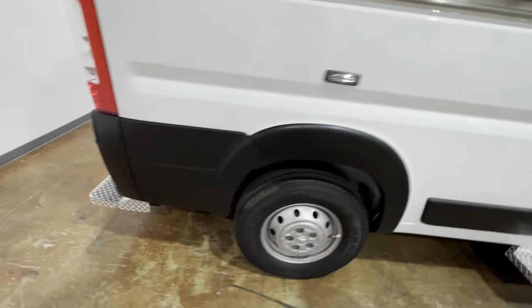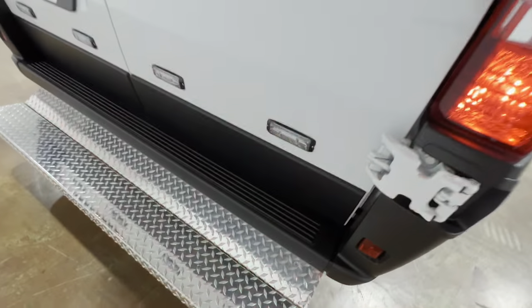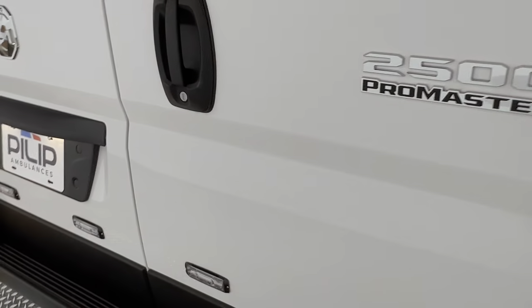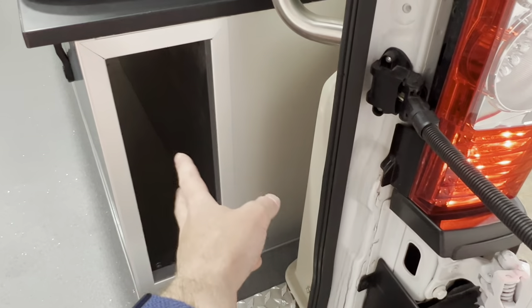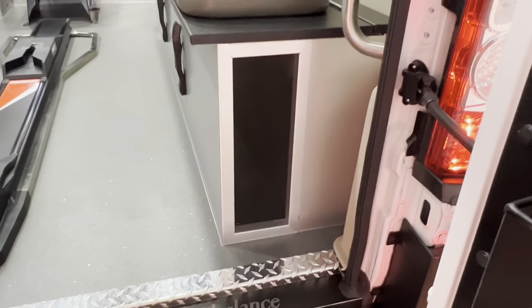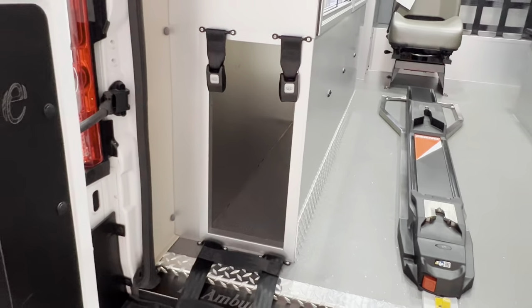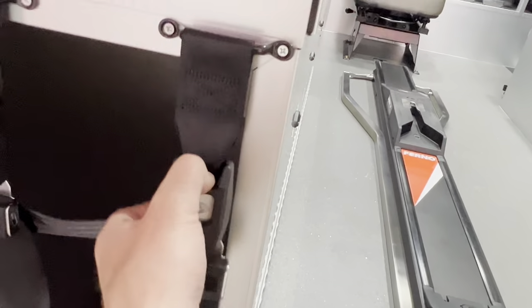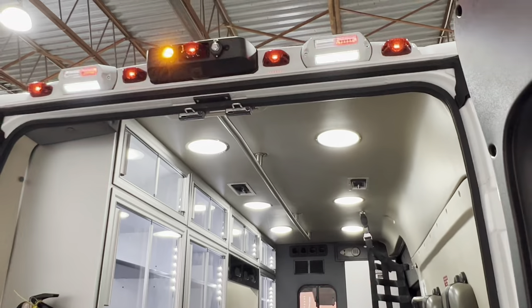Coming around to the back of the ambulance — this is a flip-up rear step, so that flips up. Your backboard goes inside here. This has room for probably three backboards depending on what kind you use. And then your stair chair would go inside here. I know this fits a Stryker stair chair with tracks — not really sure about the Ferno, but I think it should fit as well. And those are your emergency lights and scene lights.